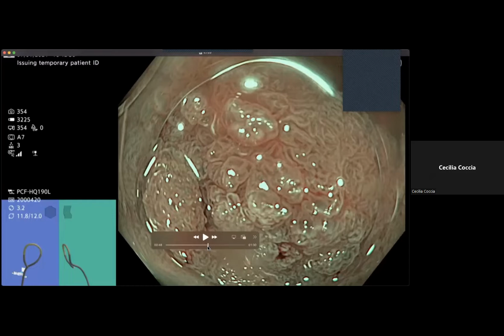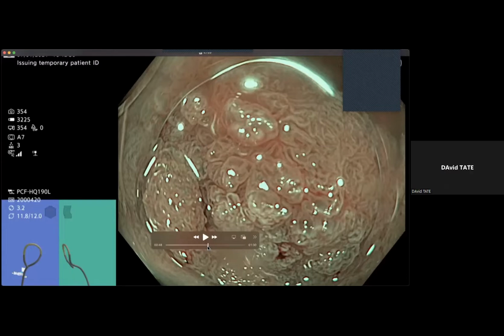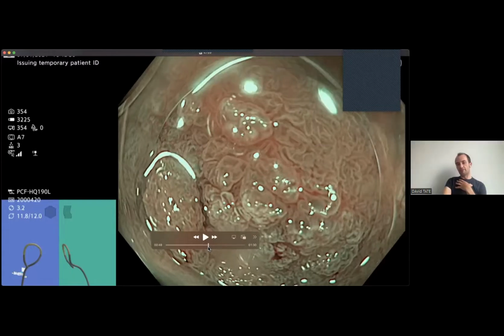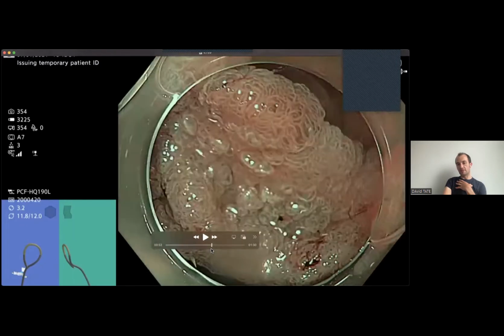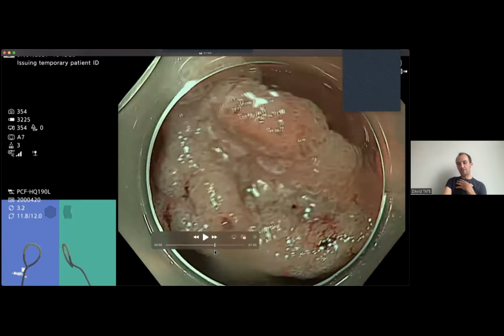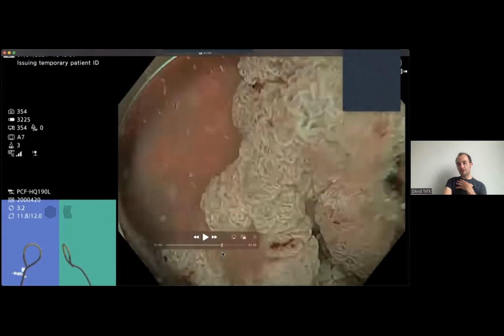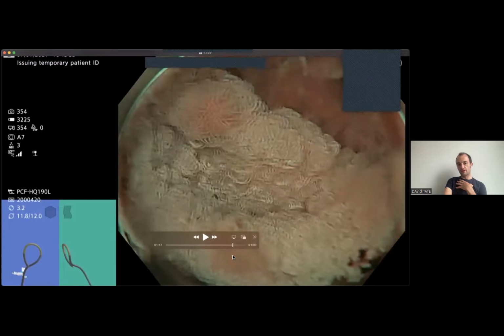I think it's irregular. Okay, and if it's irregular for you, does it have some maintained structure or is it completely irregular? There's some maintained structure. Okay, I would agree with that. Actually, I think that's probably just the way that the polyp is lying. When you look at it like this, it's probably completely regular. But I agree, if you went down the line of some maintained structure, you'd still be doing fine with that. Maybe we can get it better with underwater imaging.